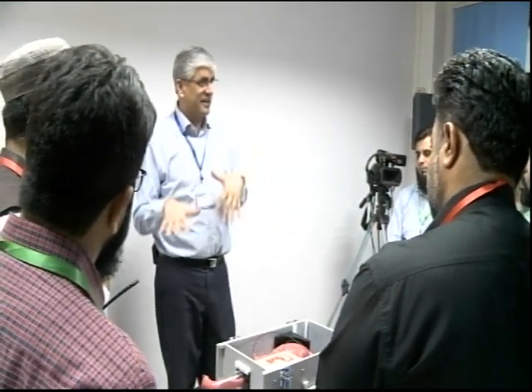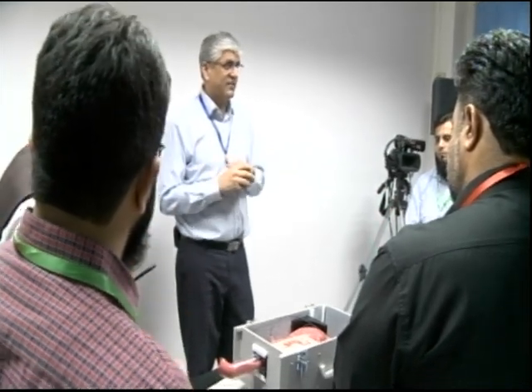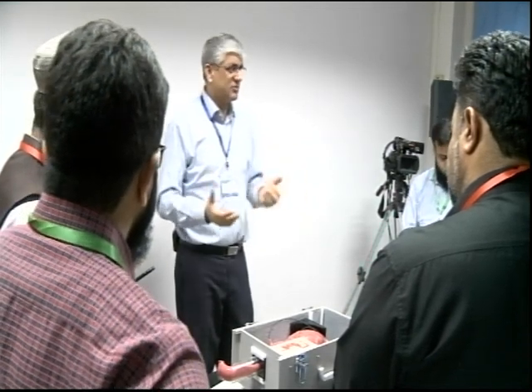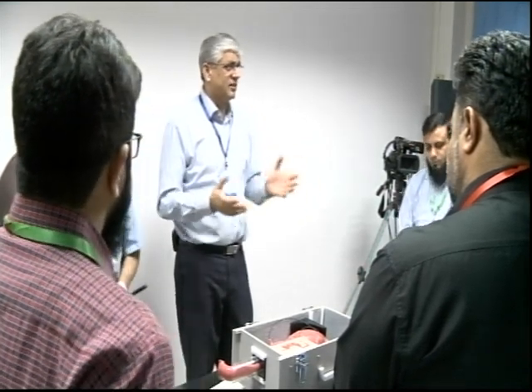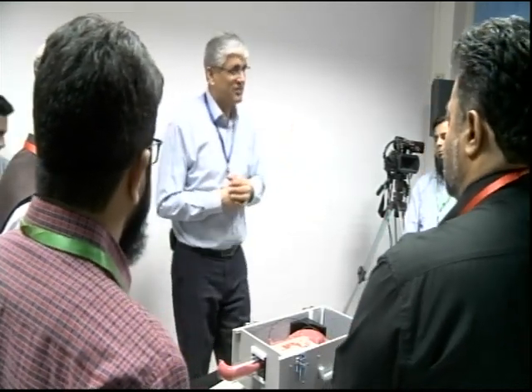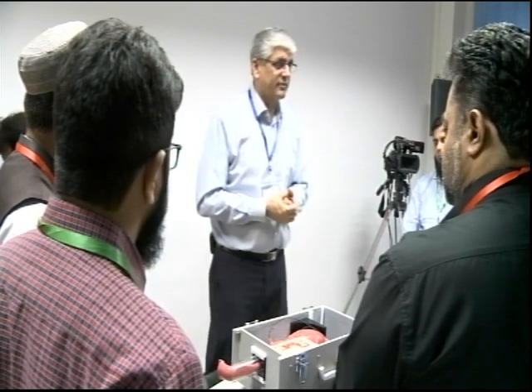Young females, I prefer that they are done under propofol. But repeats, I'll never do without MAC or general, whatever the anesthetist is. Now, like yours, we have an anesthetist here on the 3 days that I come here, and we have anesthetic backup, and I will use it in patients where I need. Otherwise, we'll just do standard stone cases, etc. You just go ahead and do it under sedation. It saves time and obviously it's also cost effective.